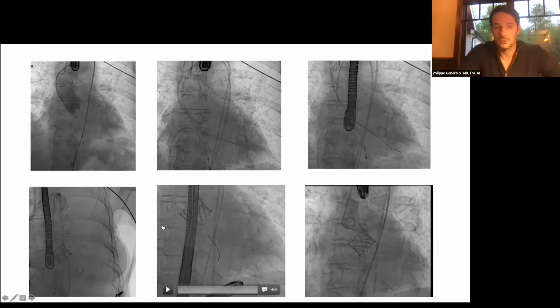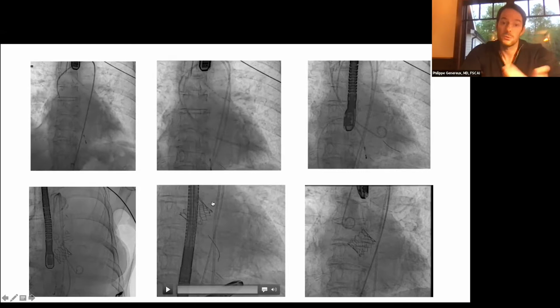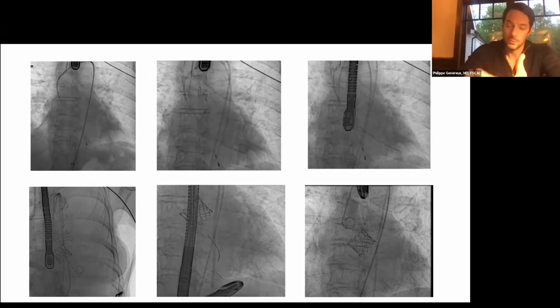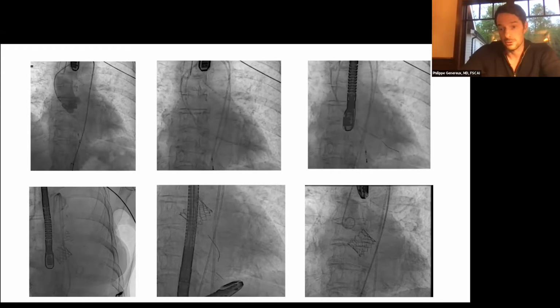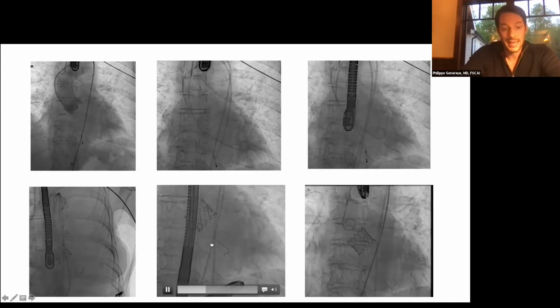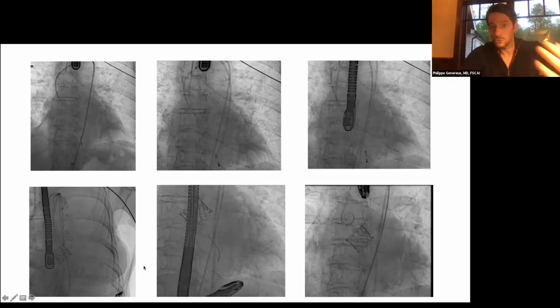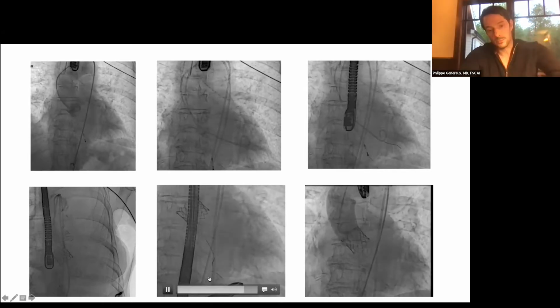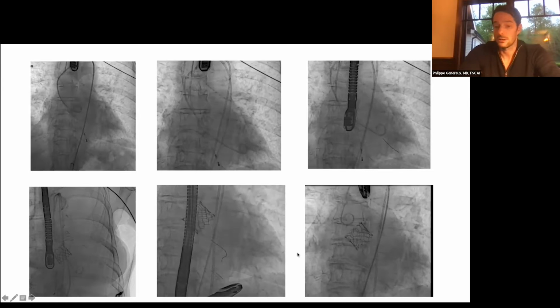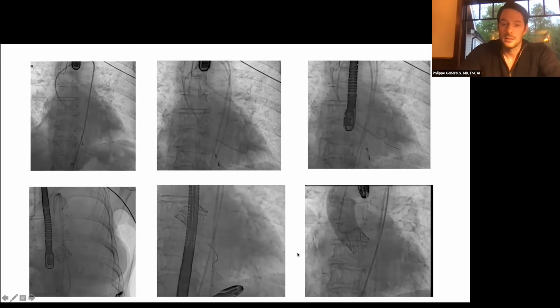So we were doing a typical TAVR. We did a root shot first. Then we crossed the valve, measuring the gradient with two pigtail, two transducer. After that we used the sensor of the OptoWire. Then we did the TAVR successfully in all cases. We remeasured the gradient with two pigtail again, and after that we put the OpSens wire in to get the gradient. Then we did a root shot for the AI.